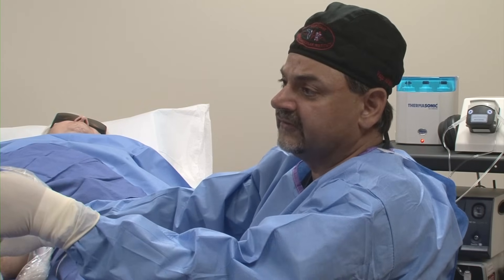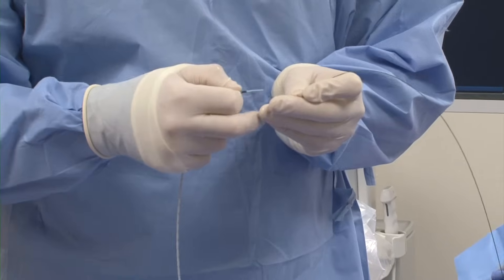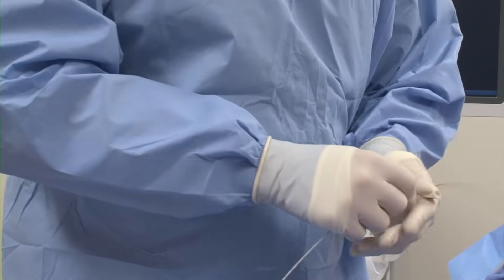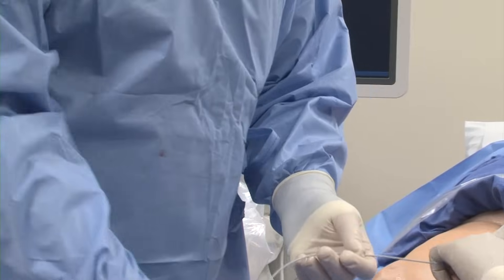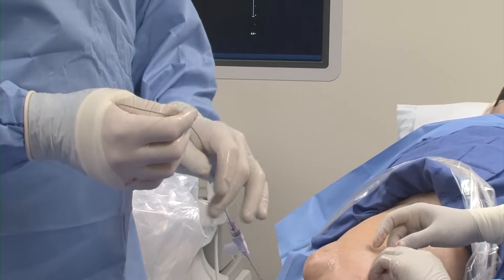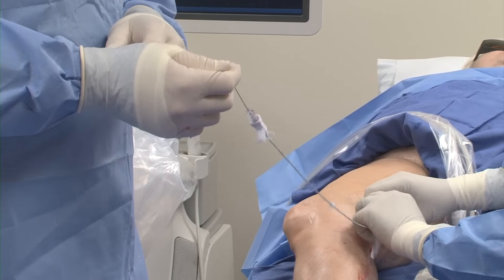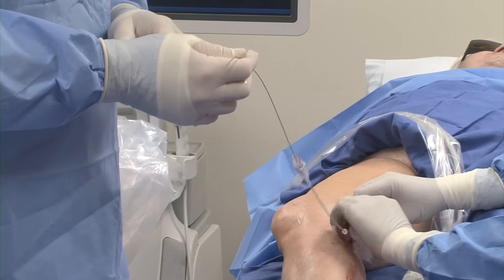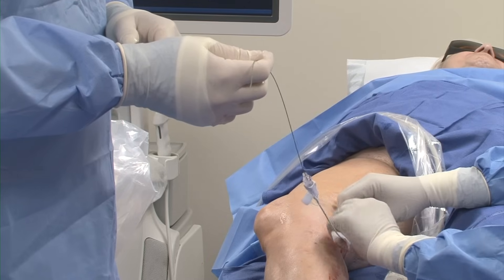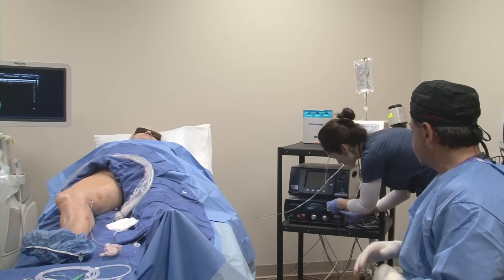Jason will now load the catheter onto this 0.035 wire. This is an over-the-wire system, and in a case like this you really want to have a wire handy, especially since we knew we were getting into a procedure where the vein had been previously ablated and was tortuous. The catheter went in very smoothly. This is a 60-centimeter catheter with markings at every centimeter, so we are about where we need to be. Now Dana is going to attach the fiber to the actual pulse generator.